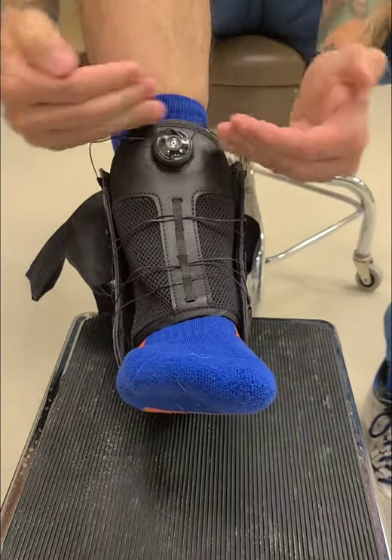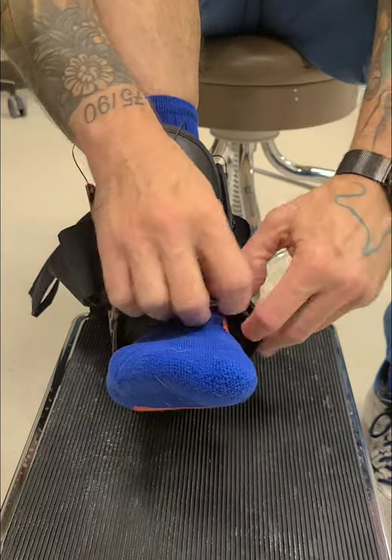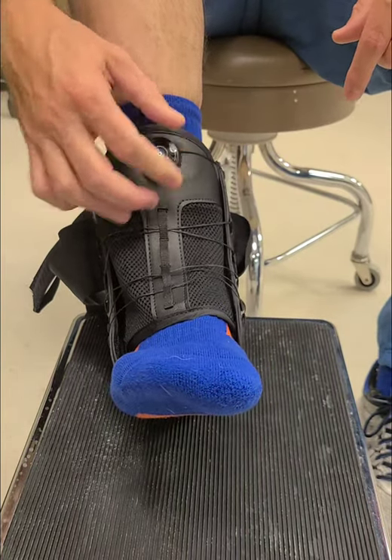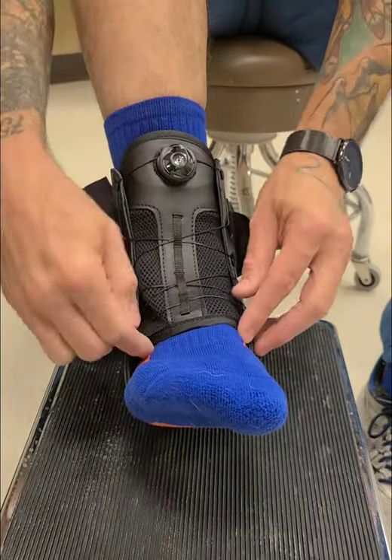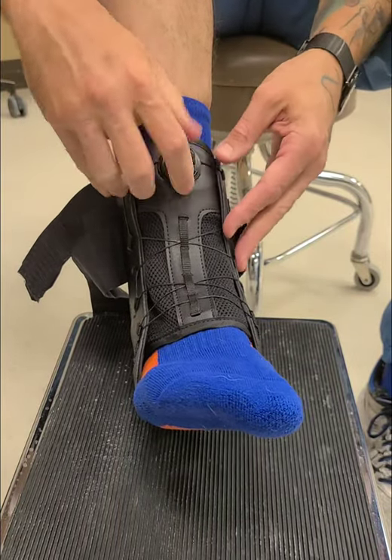We make sure our tongue is level and not twisted. We make sure the corners aren't popped out. Once we get it set where we think we need to be, we push in. We'll start hearing that clickety click and you'll see it's starting to tighten down. As we're doing that we need to pay attention to all aspects of the brace — make sure it's straight, level, and everything's going as planned.